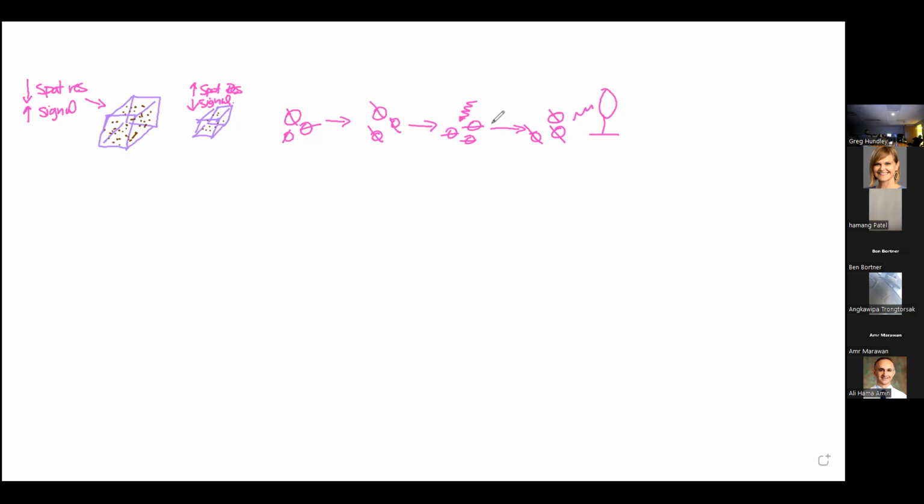Who's had an MRI before? What was your MRI scan of? Cervical spine. When you were getting ready for your scan, what did the technologist want you to do during the scan? Do not move. Exactly. They wanted you not to move, because this whole imaging process is very sensitive to moving around.